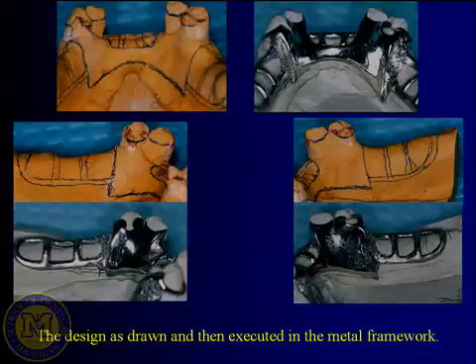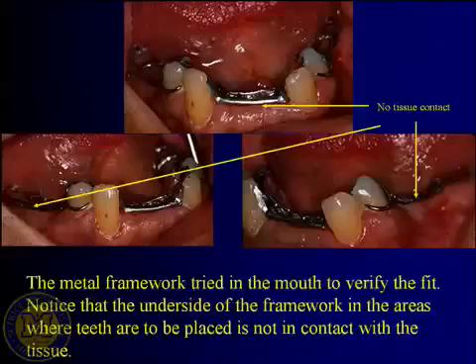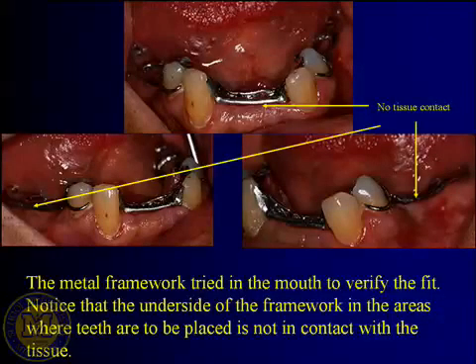So we made any changes to the teeth that were necessary for the mouth preparation piece, took a nice impression, and got that ready to send off for a framework. So now the framework comes back, we try it in the patient's mouth, make sure the framework fits well. So we say, gee, the framework fits well.